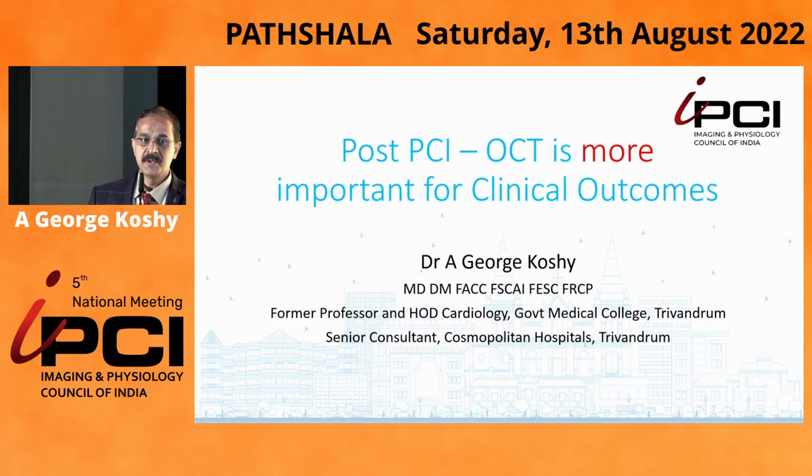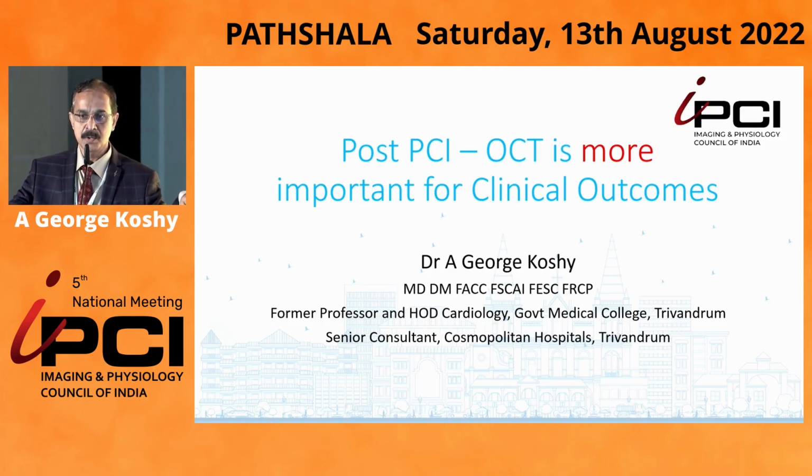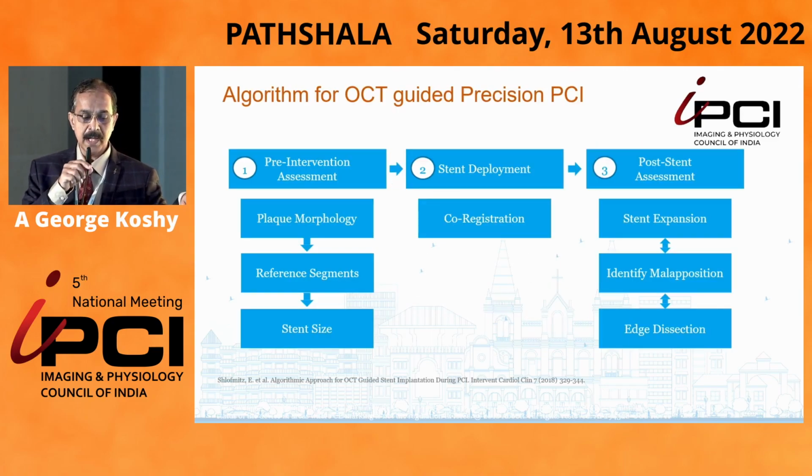Good afternoon. You have listened to the importance of pre-PCI OCT, but post-PCI OCT is equally important or sometimes more important for clinical outcome. When you look at the algorithm for the OCT-guided precision PCI, all the three factors are equally important: the pre-intervention assessment, the optimum stent deployment, and the post-stent assessment.